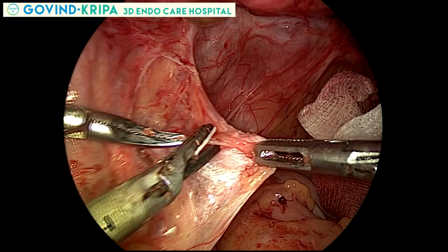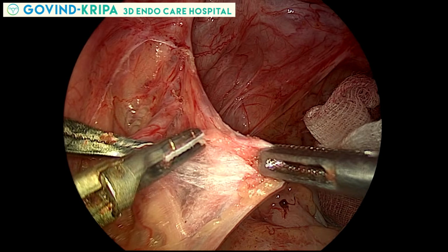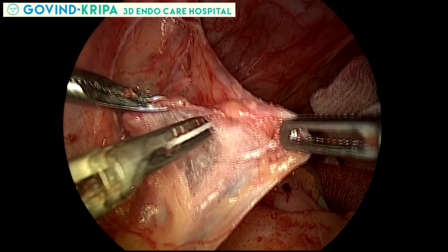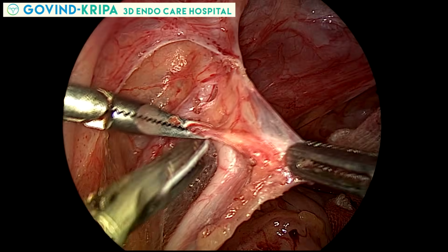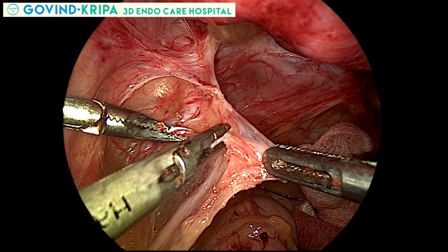Coming back to the ureterolysis where we left it, it is continued and the ureteric tunnel is reached. There is a nice crossing of uterine artery and the ureter. The normal anatomy is seen very nicely.